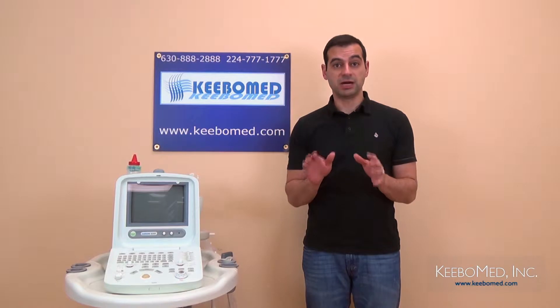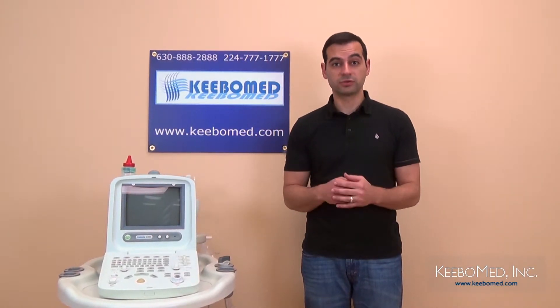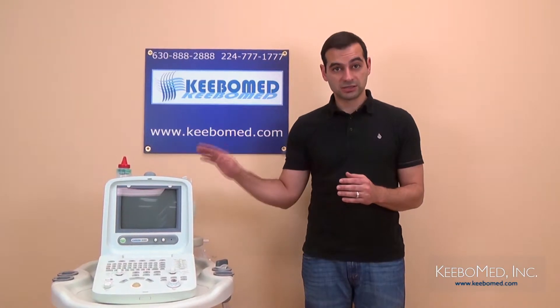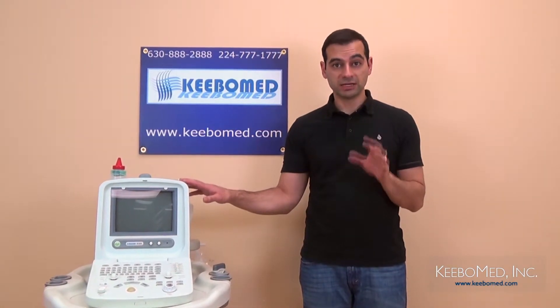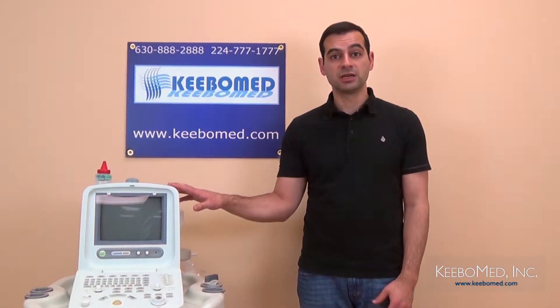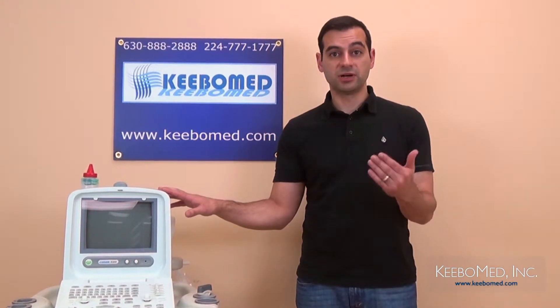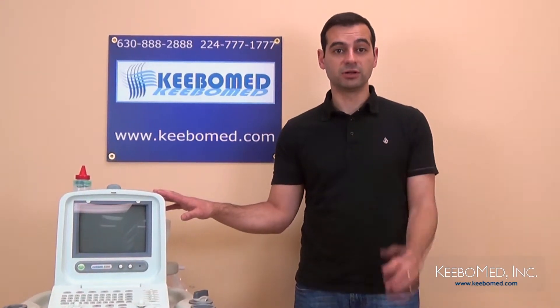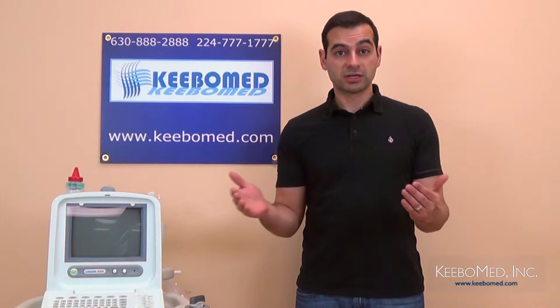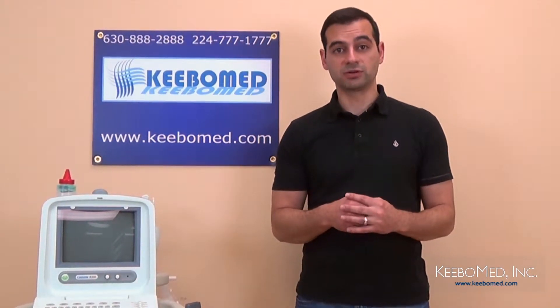The 8300 has been a popular model for doctors with a smaller budget and has sold all over the world for many years. The system is really known for its reliability. Customers have been repeatedly satisfied with its lack of problems, and it also performs many important functions. Best of all, it is available for a very low price. So let's take a look at some of the features and advantages you can expect from the Chison 8300 Ultrasound.